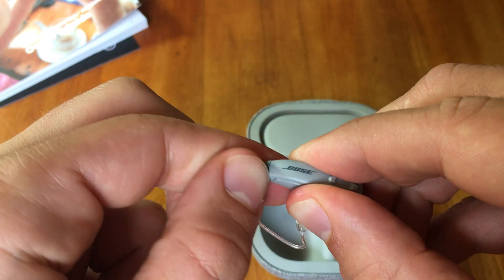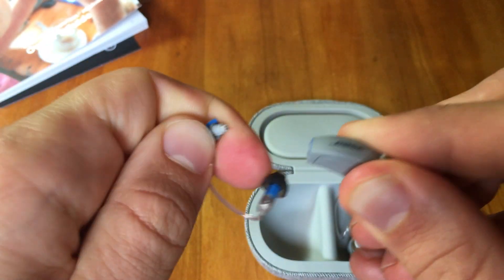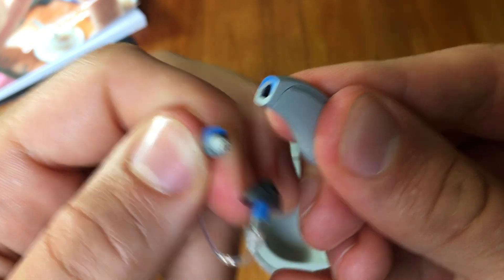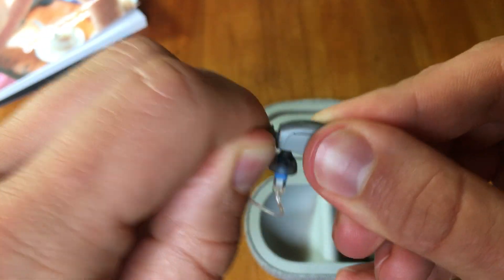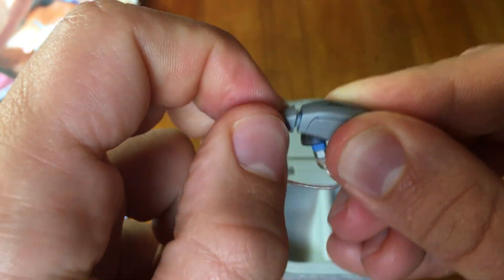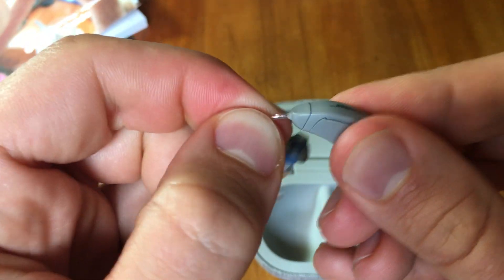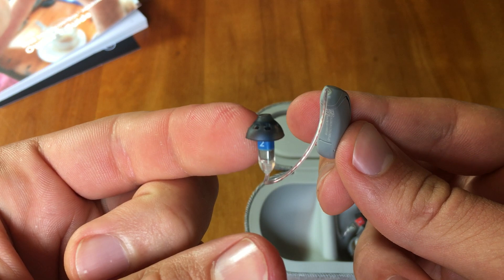To take it off, you put your fingernail or a similar object in there and remove it. Then you match the blue with the blue, and if you insert it properly it should snap right back just like that. Test it out — okay, that's on nice and secure. That's how you change the receiver wire.